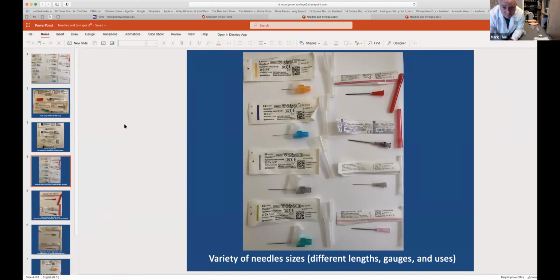I'm hoping that you all can see this. We're going to be going through needle theory first.